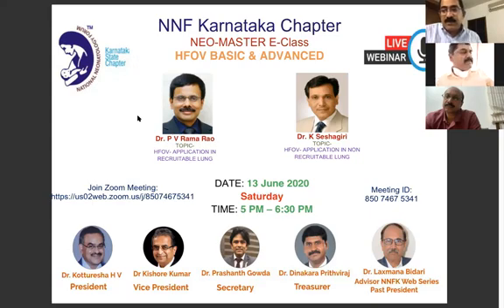Sir, one more thing. Satish Ganta sir, in Sensor Medics there is 33%, where I took my fellowship. But now I am buying a Fabian machine. In that Fabian machine, 1:1, 1:2, 1:3 is there. Sir, when do we use this 1:2, 1:3, 1:1?